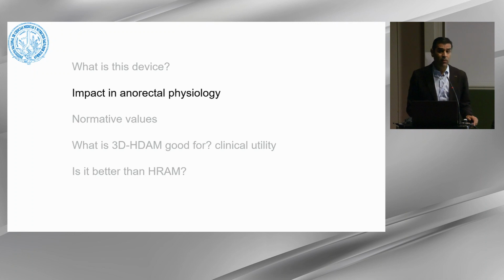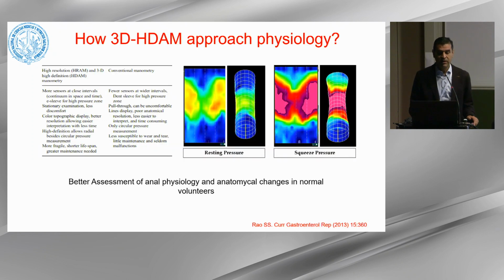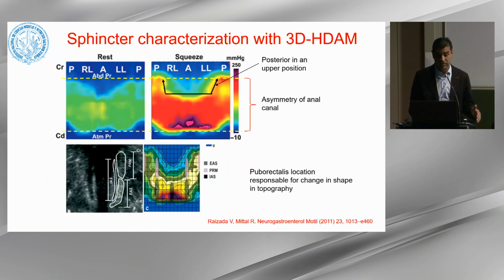So what I really think this technology has provided us is a better impact in the understanding of anorectal physiology. With these 3D topography plots, we can now have a better assessment of the anal physiology and the anatomical changes in healthy volunteers, but also in disease.